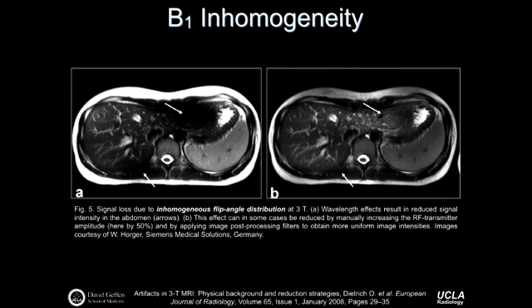And so what's being shown here is that as a consequence of B1 inhomogeneity, some poor design of, or poor use of the system that's in place, you can end up getting dark spots, for example. And MR can be tricky. It's very difficult to identify or reverse engineer why a particular artifact exists. What's the underlying mechanism or cause for that artifact? This is a paper that was about artifacts at 3T imaging, so we know specifically this is a B1 inhomogeneity artifact. And they made some tweaks on the system, and they can flatten that out so that they get a much more uniform image intensity.